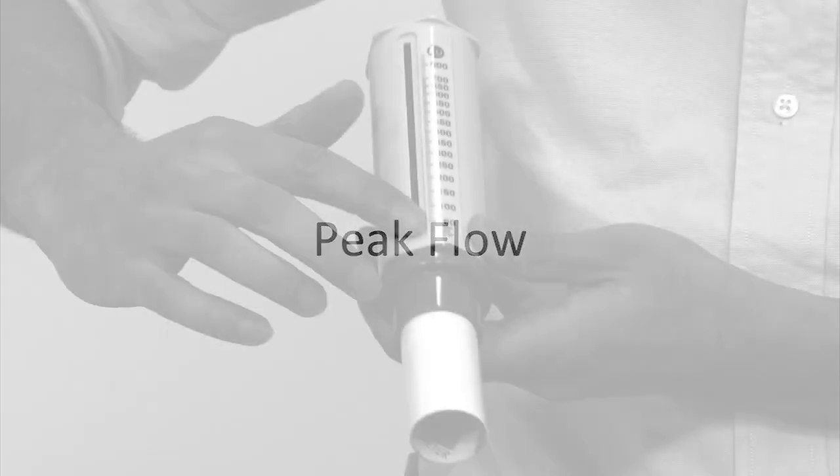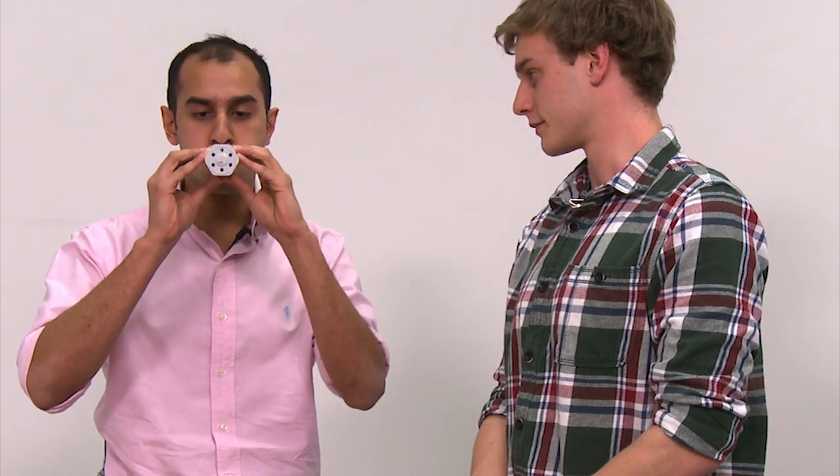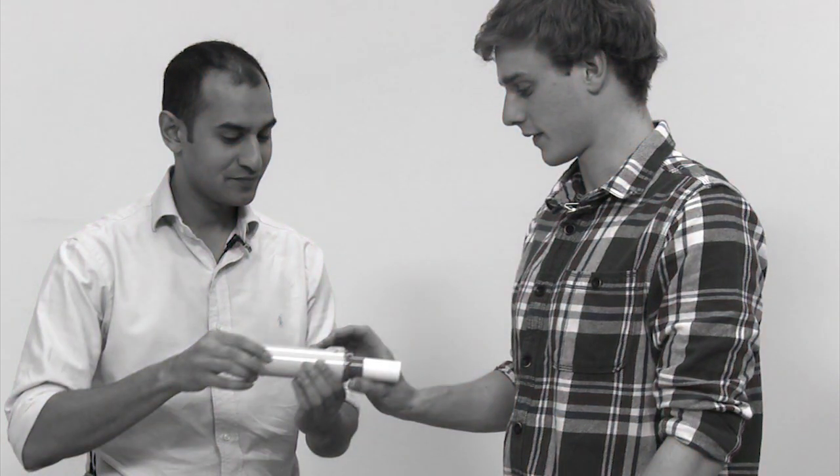For peak flow measurements, you will need a peak flow meter and a single-use mouthpiece. Now we're going to do a test called peak flow, which involves you blowing out into this tube. Peak expiratory flow rate is very simple, widely available, and commonly used in both the diagnosis of asthma as well as in the monitoring of response to treatment. For this test, I'd like you to stand up, hold the peak flow meter like this, take a nice deep breath as before, form a nice tight seal around the tube with your lips, and then blow out as hard and as fast as you can. The peak flow reading should be taken either standing or sitting up straight to ensure good expiratory effort. It is also important to ask about the last inhaler use to put results in context, and to measure the height to compare results with predicted values.